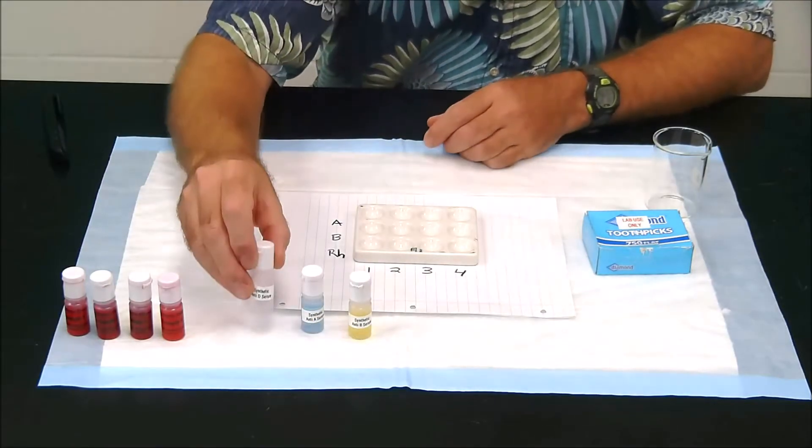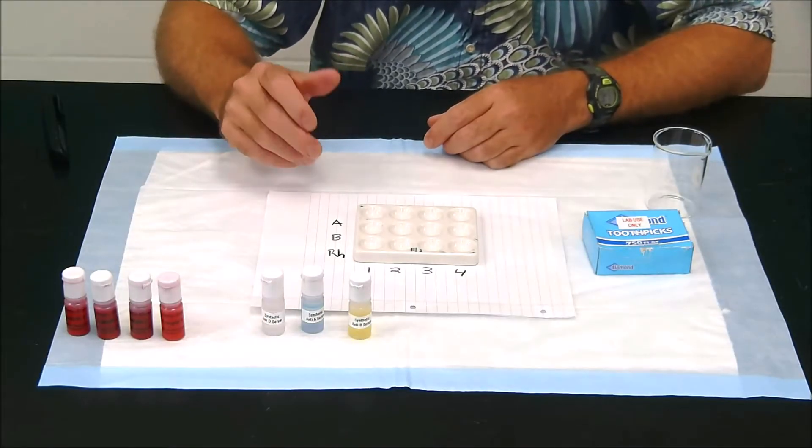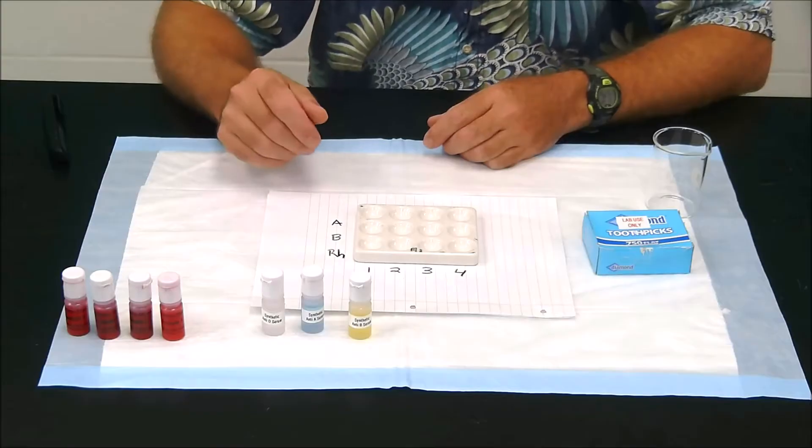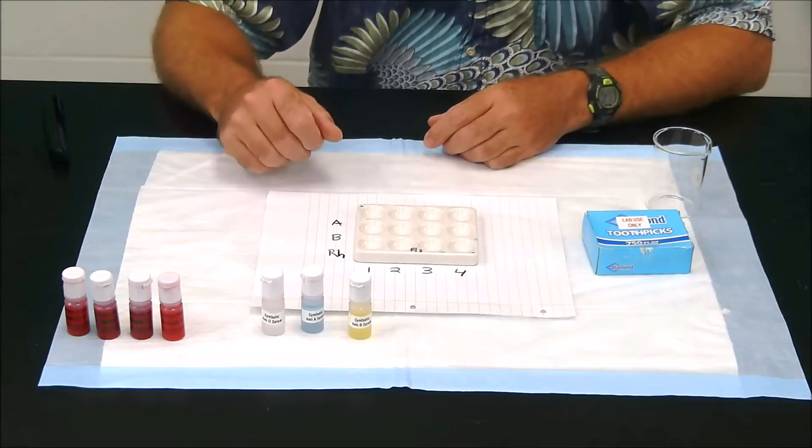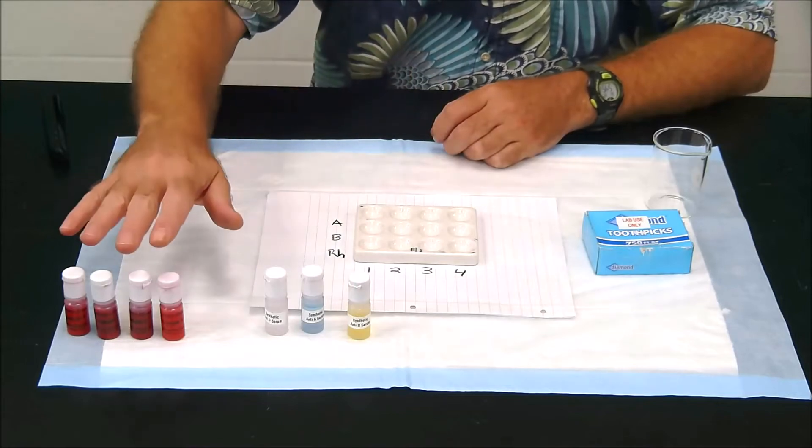Remember, the blood types that are most common are ABO, and then we have Rh positive or negative. So using these anti-sera will help us to determine the blood types of our mystery blood over here.